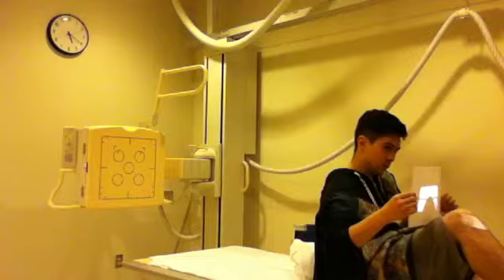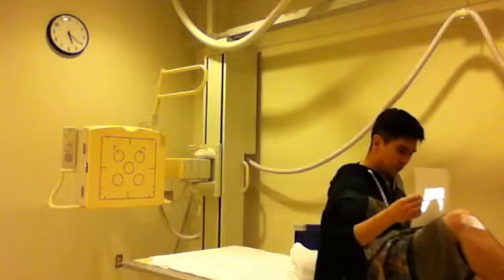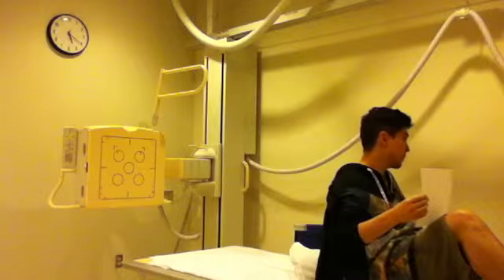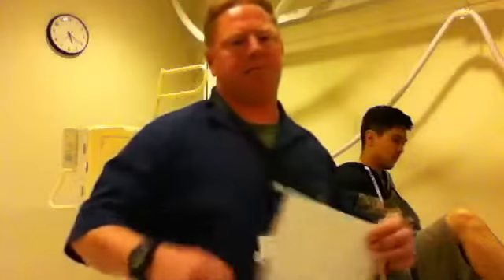At this point, it's a pretty simple 60 at about 3 or 2, and then hold still or look away before I shoot, and then shoot, and then I come back in, grab it, relax, and run it in the reader.